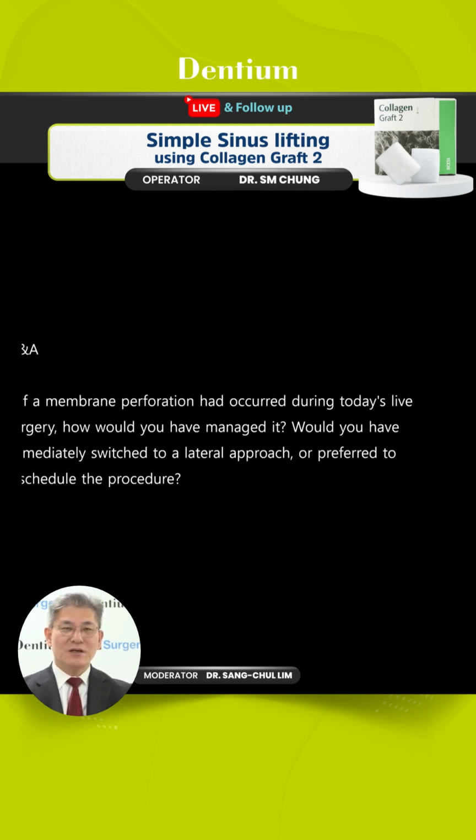If smaller than 2 millimeters, about 2 or 3 millimeters, just the collagenated bone graft packing is enough to perform the sinus elevation without any graft scattering into the sinus cavity when you use this collagenated bone without any membrane, right? So it is the standard, established protocol.